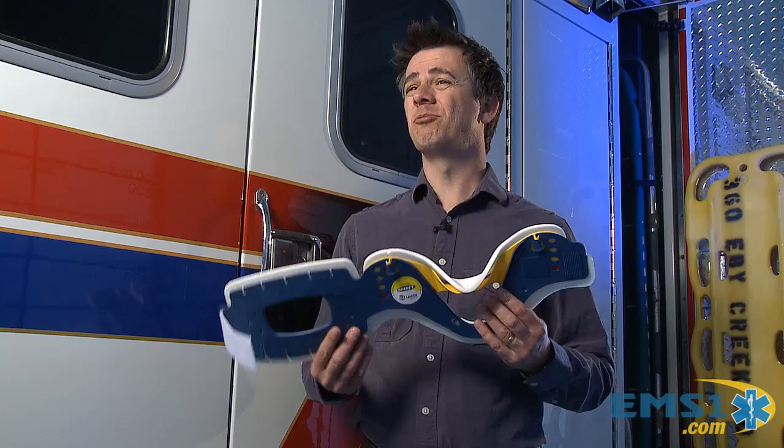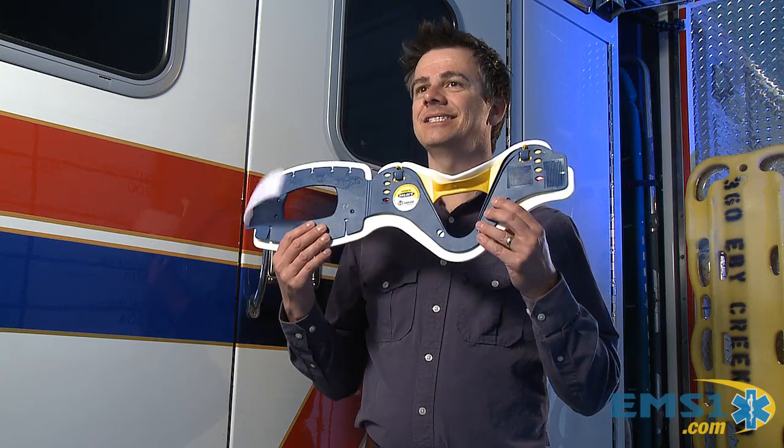As EMS providers, the most common thing that we splint is the neck and the back. I've been doing it 20 years and I've splinted more necks and backs than I have arms or legs. And if we really look at it as a splint, this is kind of the industry standard. We've been using this a long time. It's opaque, it's foam, and it's really hard, rigid plastic.